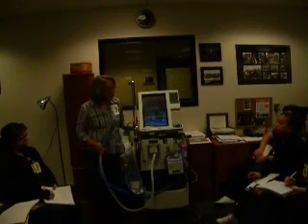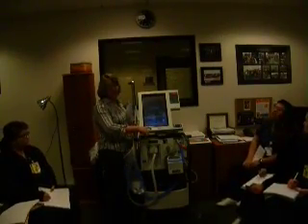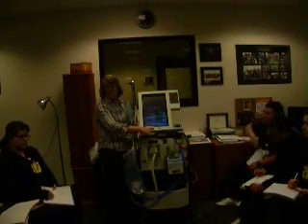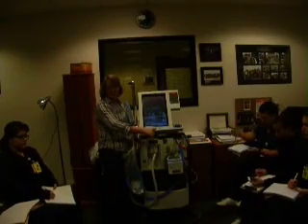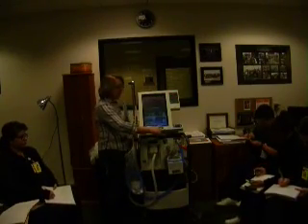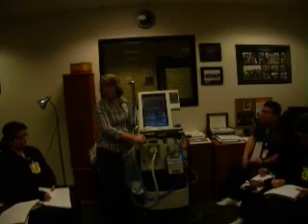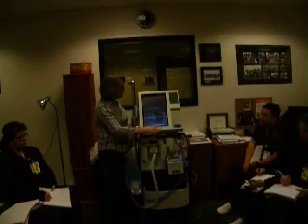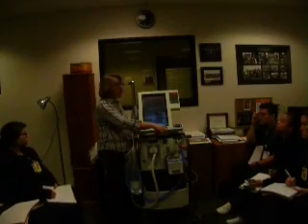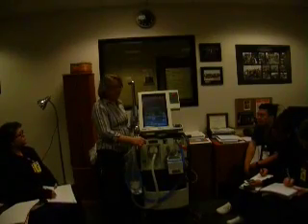So it's very short. Down here on the bottom, you have volume. So if you want to make sure that your alarms are on the highest volume. This is a 2-minute alarm silence right here. This is a reset. So if I silenced it and I want to reset it, that's the next button over. Then over here on this side, you have 100% O2, which we will use for suctioning. You'll push that button, your patient will get 100% O2 for 2 minutes. Of course, we can't do that right now because we have no oxygen. Manual inspiration, if you just want to give your patient a breath. We rarely use that feature anymore, but it is on all the ventilators.